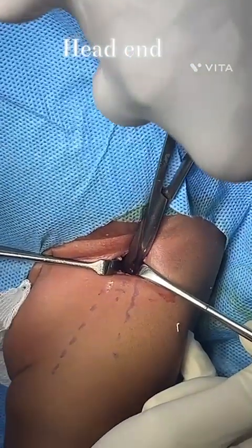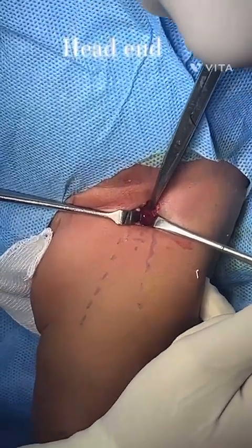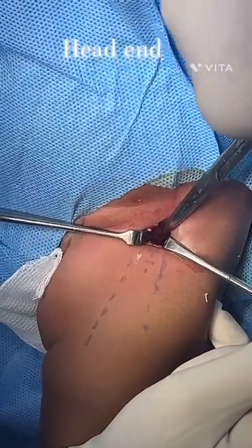Once we do the capsulotomy and open the capsule, there is a serous fluid that is coming out of the joint that confirms that we have opened the joint.